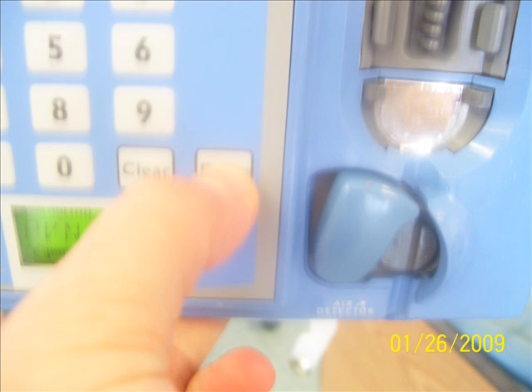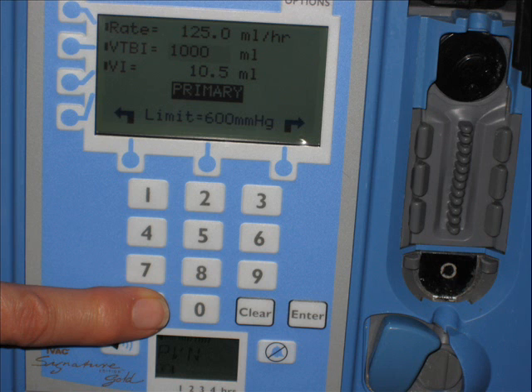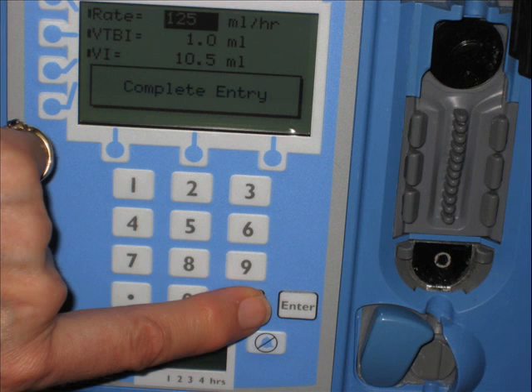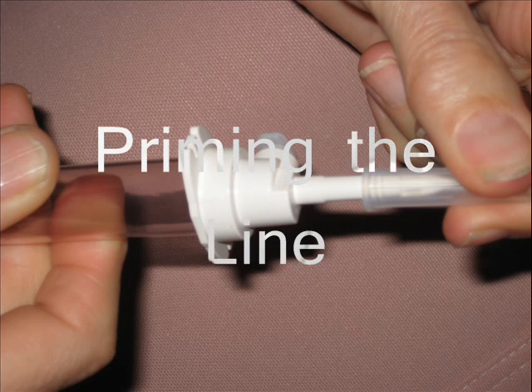The volume infused means only how many CCs were given to our patient, and at this moment we want to make it zero — press enter. After pressing enter, we will locate our run button on the right side corner and press it.